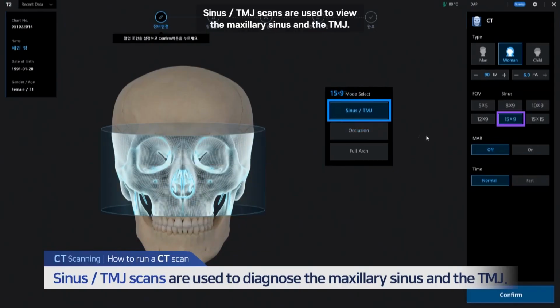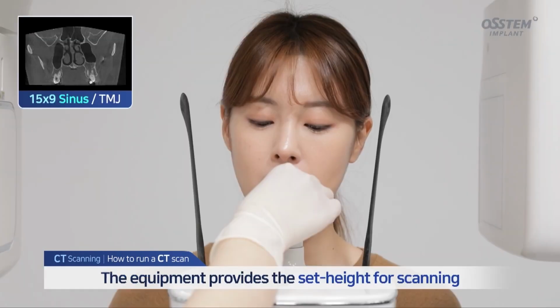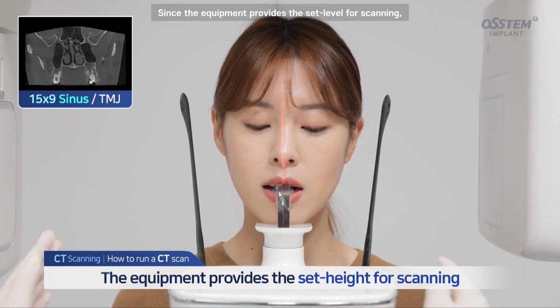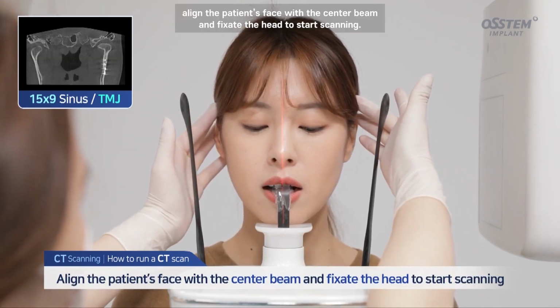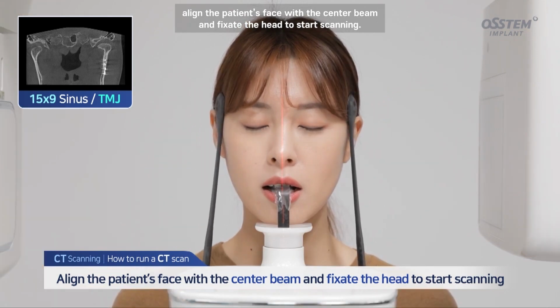Sinus TMJ scans are used to view the maxillary sinus and the TMJ, since the equipment provides the set level for scanning. Align the patient's face with the center beam and fixate the head to start scanning.